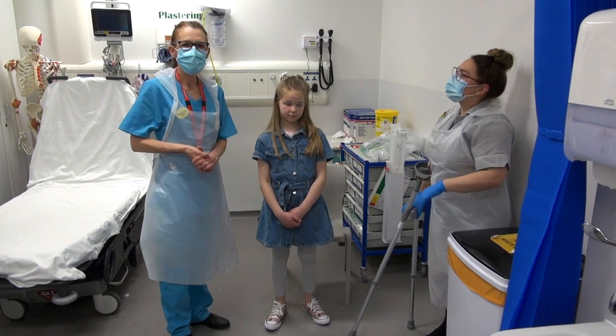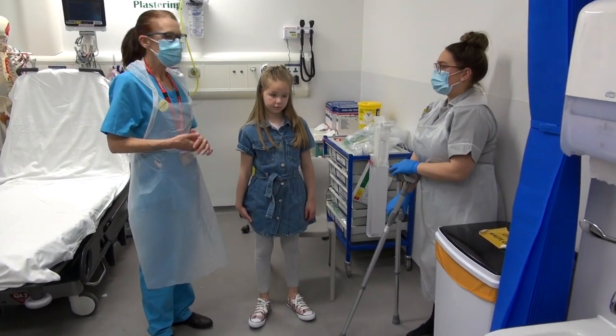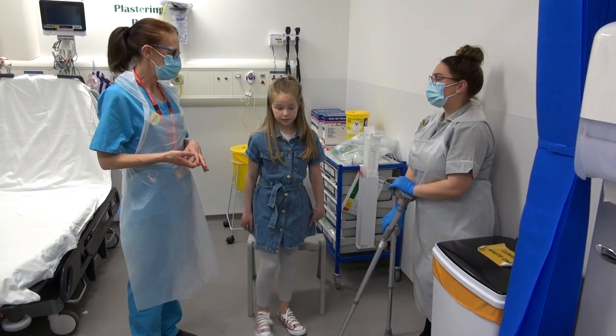We're going to show you how to measure up and demonstrate how to use some elbow crutches. Advice is really important when you're dispensing any crutches to a patient.